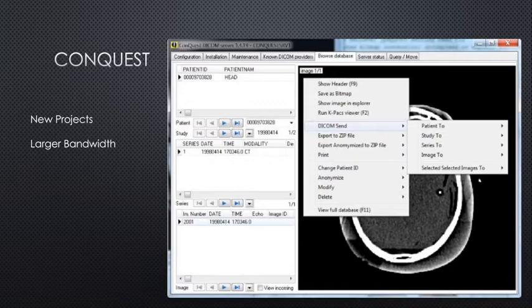Then we click Change Patient ID, and it does a very one-size-fits-all, not very customizable stripping of all headers that contain PHI. The problem with this is there's quite a few custom headers, such as patient address and patient provider, that do provide some reference to who this person is. So it's kind of borderline for PHI.